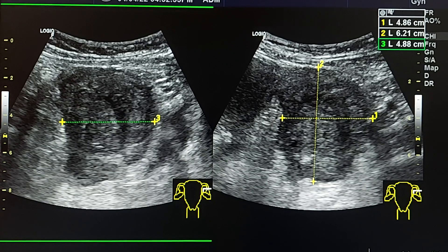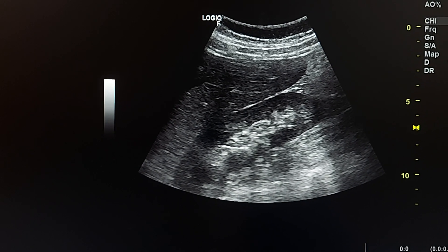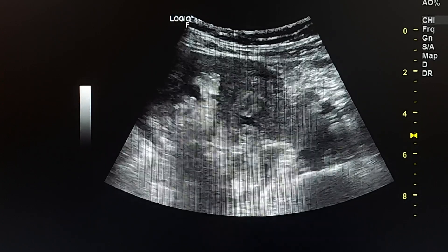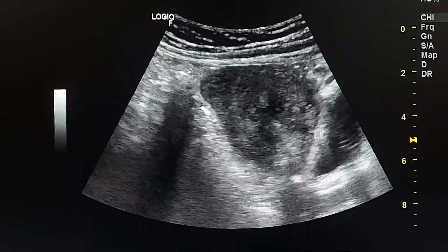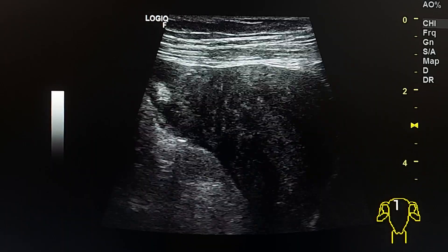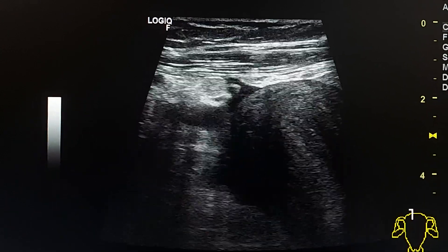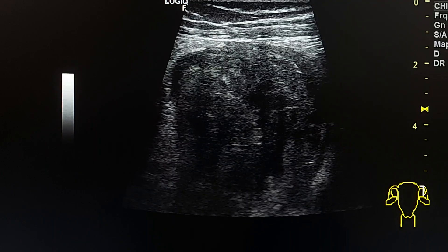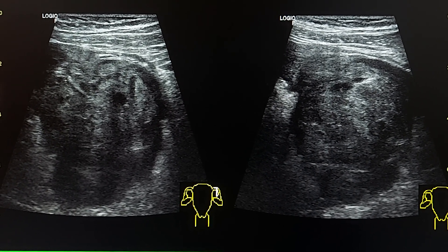The mass is large, measuring five by six by five centimeters. There is no free fluid in the Morrison pouch or the hepatorenal pouch. Using the linear probe in coronal section, we see free fluid in the pelvis. The mass appears heterogeneous on the linear probe, and the left ovary is not identifiable separately from the mass.